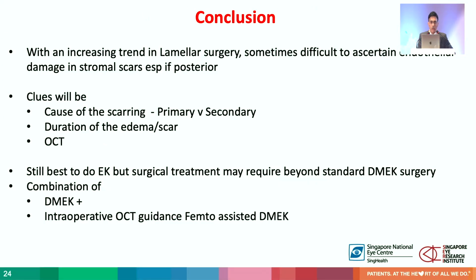So in conclusion, with the increasing trend to lamellar surgery, sometimes it's difficult to ascertain endothelial damage, especially if the scar is very, very posterior itself. The clue is the cause of the scarring, so try to think of the cause. If it's a primary cause, you're most likely going to get away with a standard DMEK. If it's a secondary cause, you may have to do an alternative technique. The duration of the edema and the scarring helps guide you.